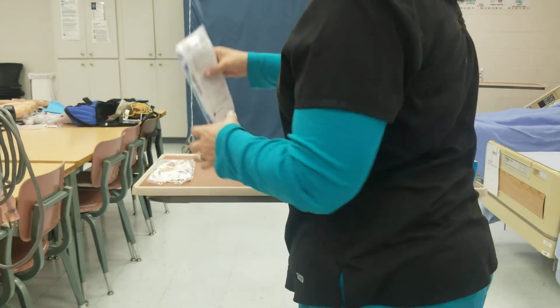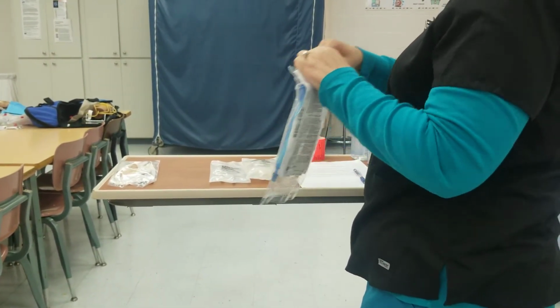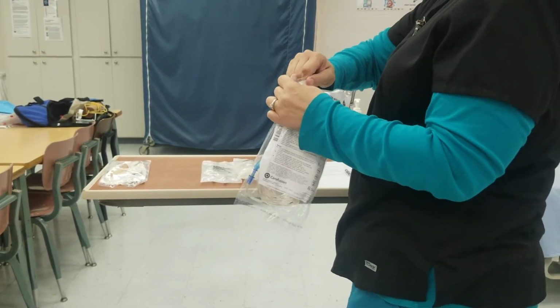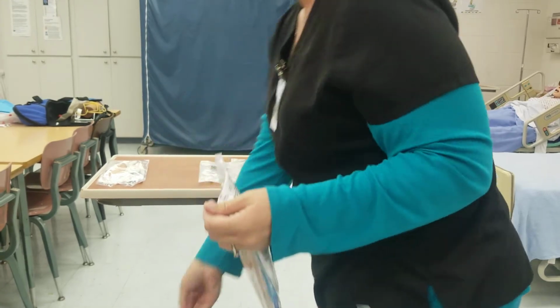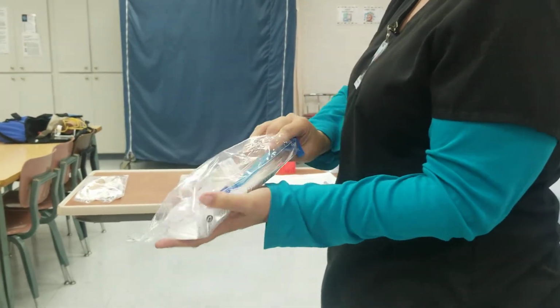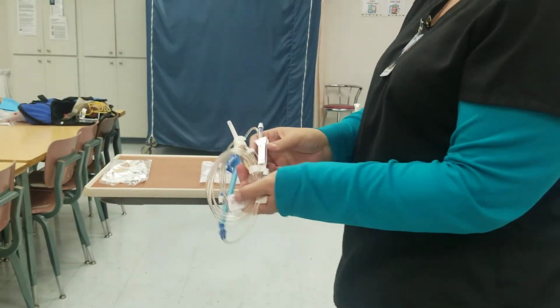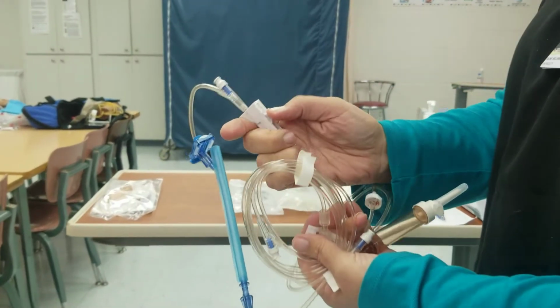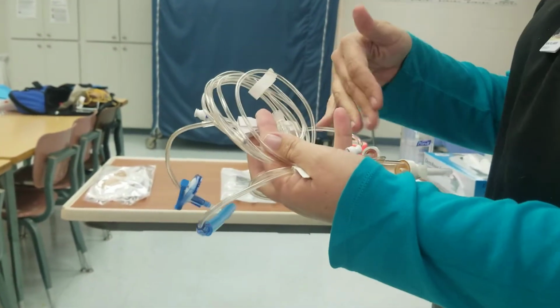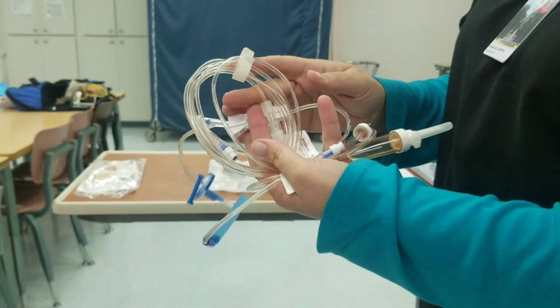So the first thing I'm going to do, we're going to take our primary tubing, and it's perforated on the side, normally. Here we go. One of the things I want you to learn, when you take this tubing out, get into the habit of the first thing that you do is you take this roller clamp and you close it, okay? Because once you get this all connected, the fluid will start going into the tubing, and then it's going to drain all over the floor if you don't do that.